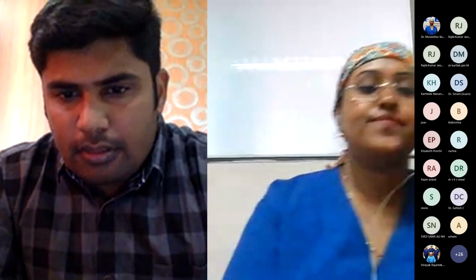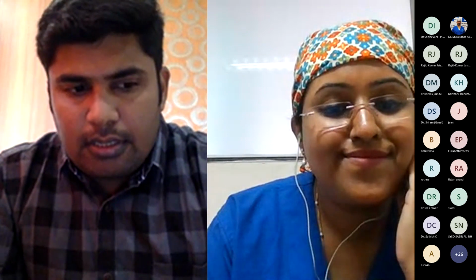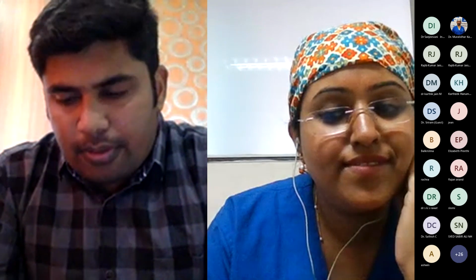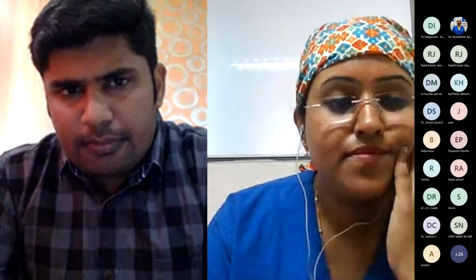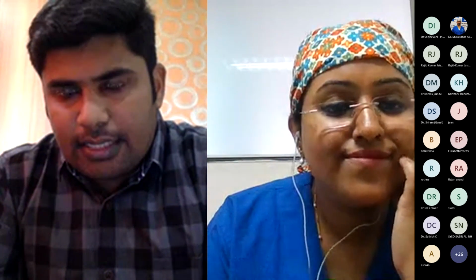Very excellent presentation, and it is certainly a difficult one in the sense that it is a very basic topic, and we do overlook it many times. I just wanted to comment on one thing which you showed. You showed pulmonary artery, Kirubanand, correct? Am I pronouncing it correctly?